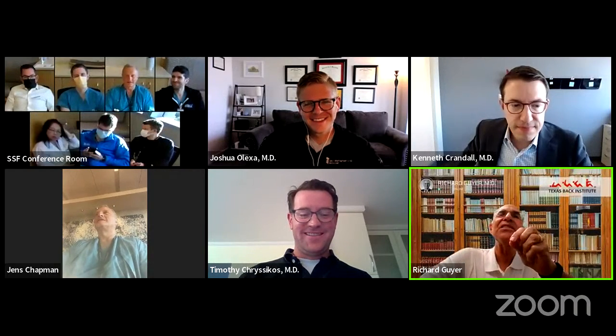Ken, what is the ideal size you think to use it in the lumbar spine if you could design yours? How many millimeters in diameter? I think that if you had one that was about a centimeter in diameter, that would be an ideal probe. Even for microdiscectomy? Oh, for microdiscectomy. Sorry, you were breaking up a little bit. I would say it would probably have to be 5 or 6 millimeters, which maybe that transsphenoidal pituitary probe is good enough, but we haven't gotten our hands on it yet. Okay, thank you.